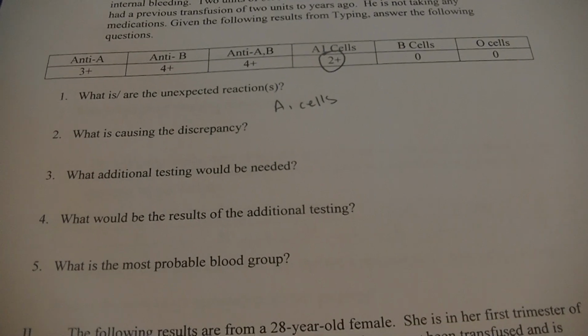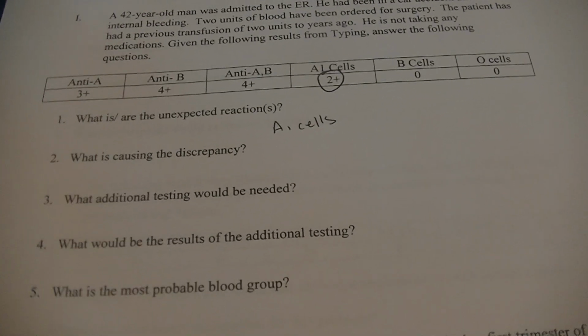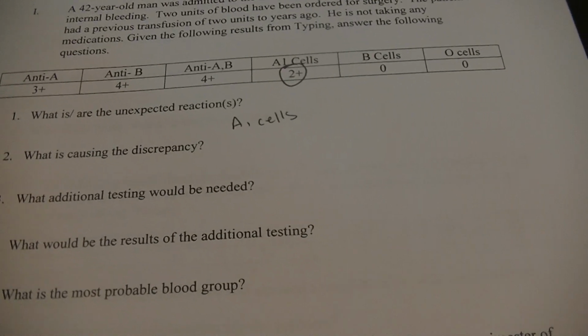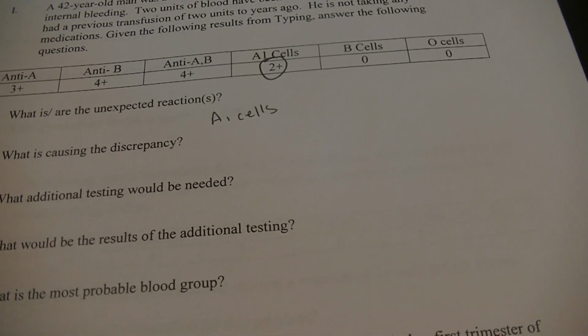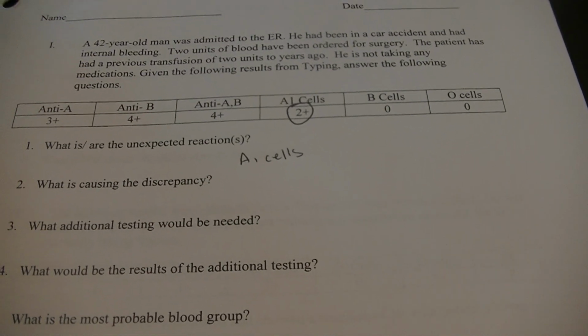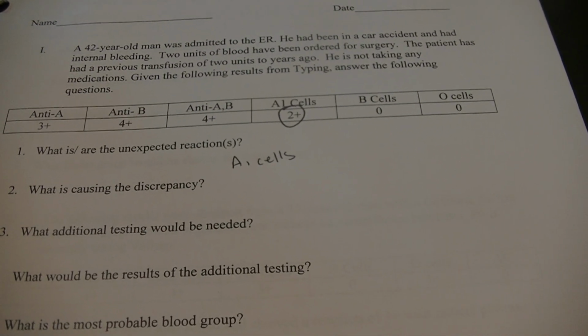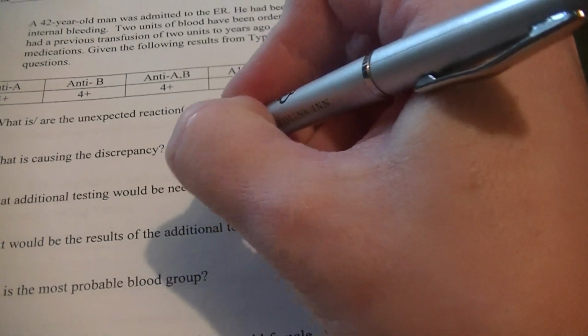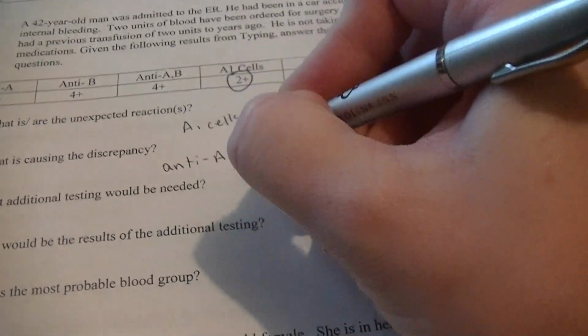What is causing this discrepancy? So if you look at the lecture for ABO discrepancies and your outline for ABO discrepancies, you will see that normally a reaction that is unexpected for a reverse type or reverse group in the A1 cells is usually an anti-A1 antibody.